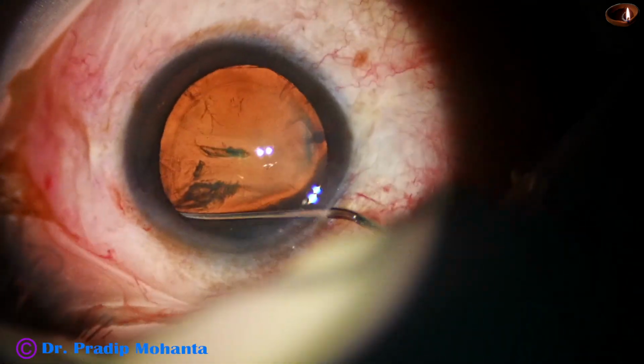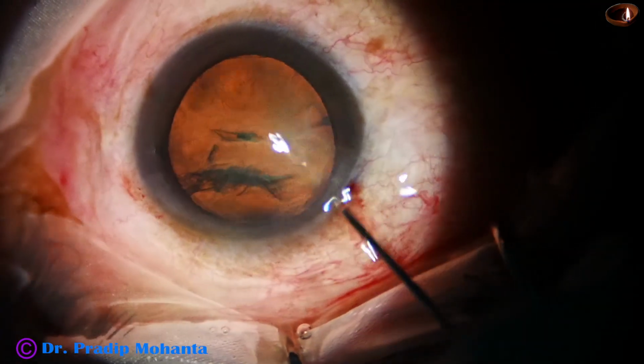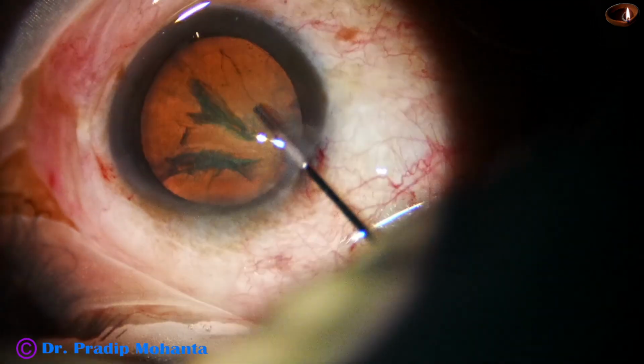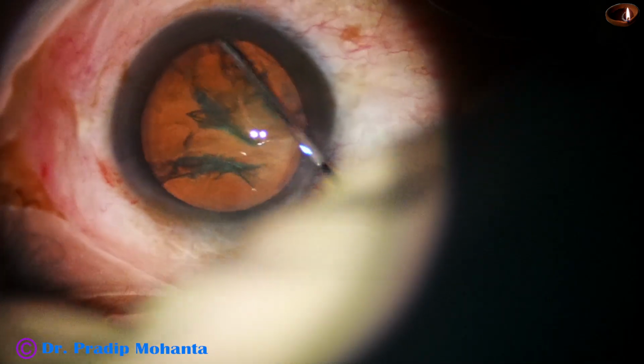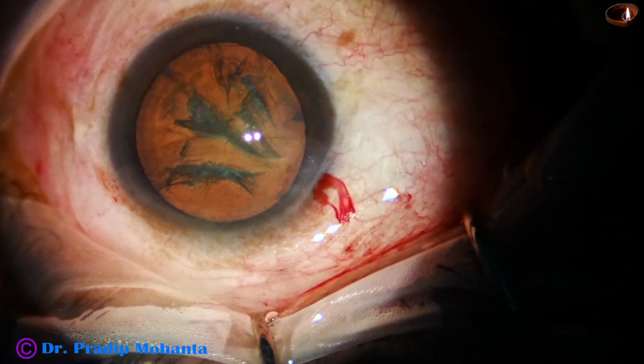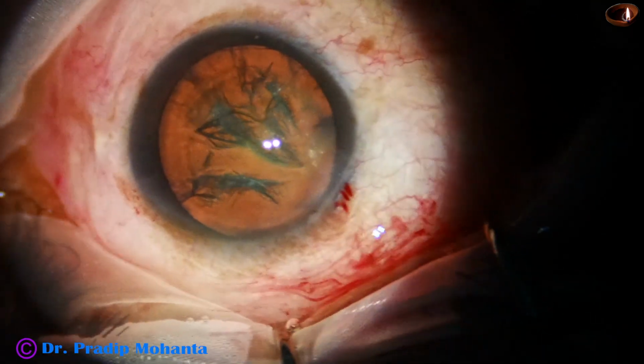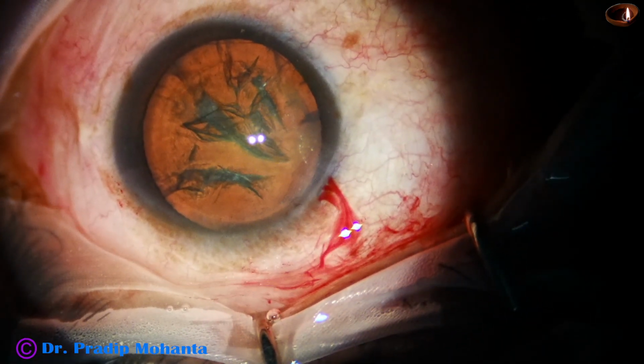Hydrodissection is done with 27 gauge cannula and BSS. After the hydrodissection, nuclear rotation is done, but in this case it has not been done, just hydrodissection has been done.